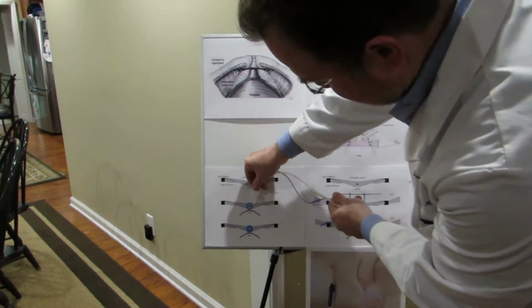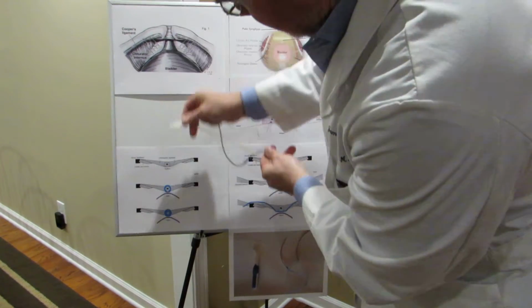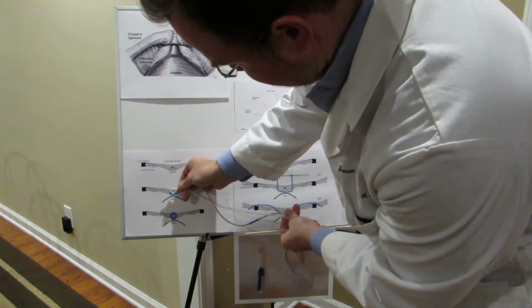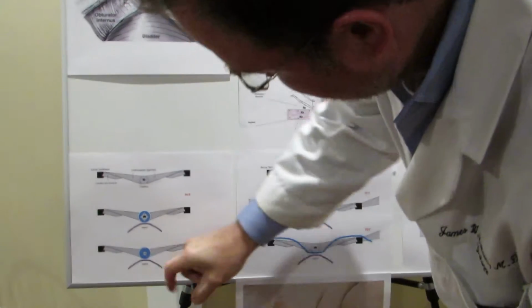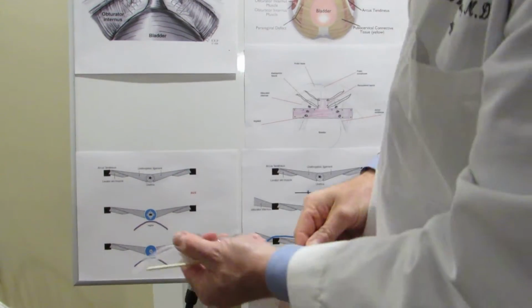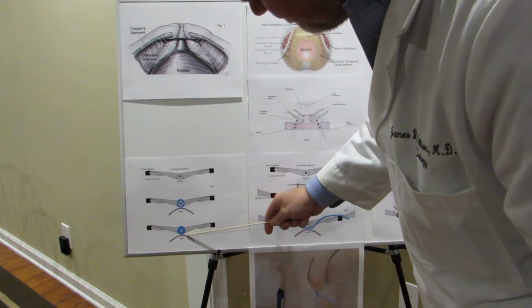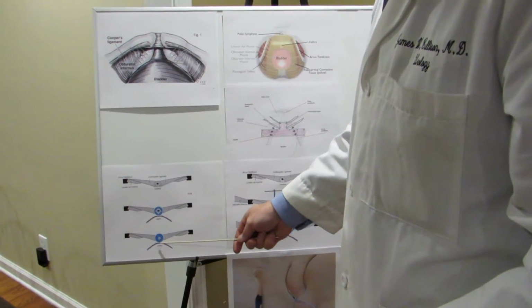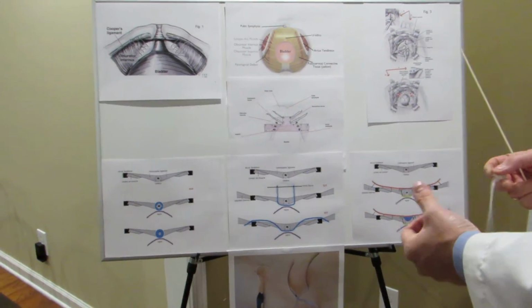Regardless, a cuff is placed surgically down in this area. You place it circumferentially around the urethra, and you're able to inflate it to squeeze in on the urethra. Now this is more bulky. That's the problem with this device: in order to occlude the urethra, this is a very bulky area, and you are prone to get infections and erosion through the vagina. This is well reported in the literature, which is one of the reasons why it's not FDA approved.